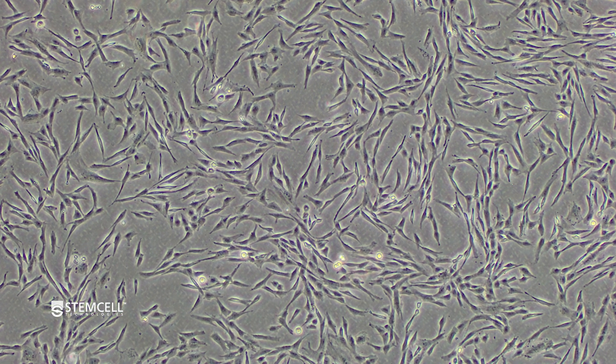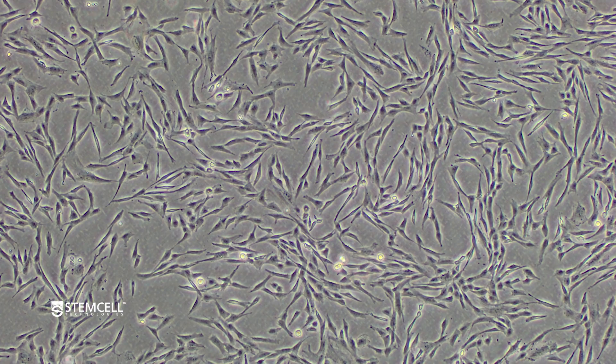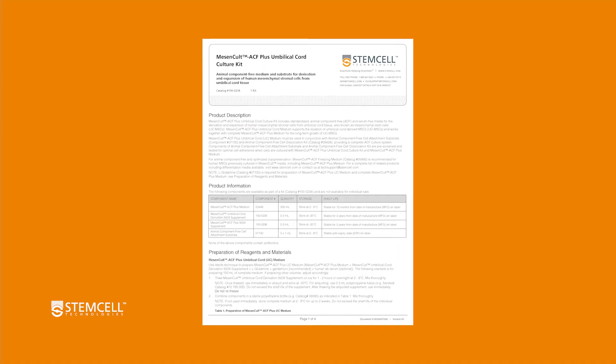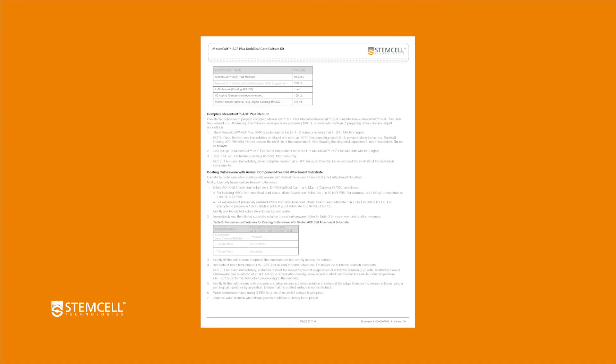If cells grow beyond 90% confluency, their growth rate may be reduced at subsequent passages due to contact inhibition. For a detailed protocol on expansion of human umbilical cord MSCs, refer to the product information sheet on our website.